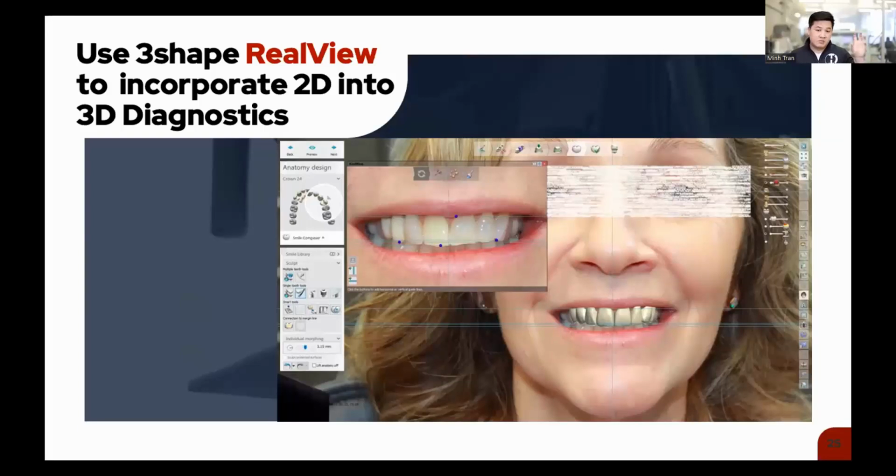And that's really the power of 3D printing, right? If I want to do one with a square style of teeth, and then I go, you know what, I'm going to save that, build a model for it. I'm going to copy my order, and then I'm going to make a triangular looking one. And I'm going to make a model so you can print both of those. And it takes you 20, 30 minutes in the Asiga.